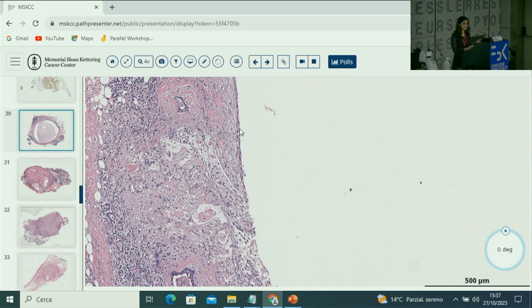At first, when you look around, you start to see that it's a bit more complex than a typical mucocele. A mucocele has a lining that could be denuded or absent, but it's a simple lining. Then when you look around, you start to see glands in the wall or the protrusion with a bit of cribriforming. I think that's suspicious. The area at the top is diagnostic. That's too much for a benign cystic structure.